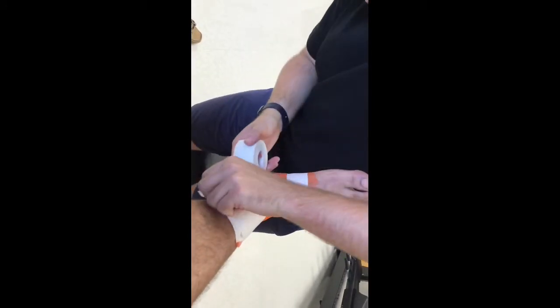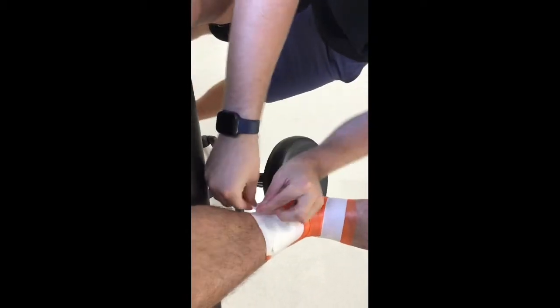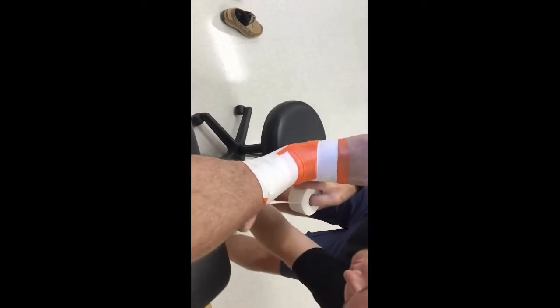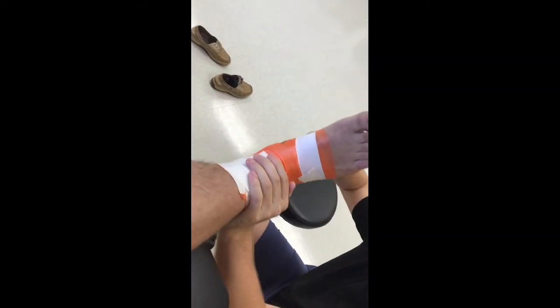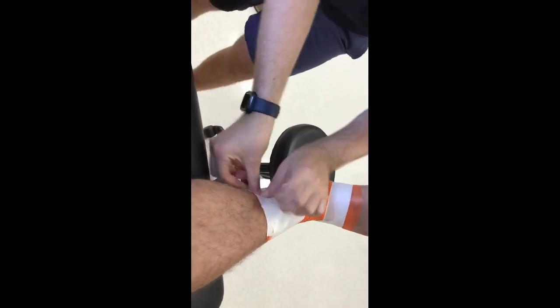Alright, now we're ready to start the stirrups. So, lateral to medial. 3 stirrups in. Our pad is still in there. Now we're going to do a couple more anchors. That's 1. And 2. We don't need to go a third one because the rest of our tape is going to cover it up.